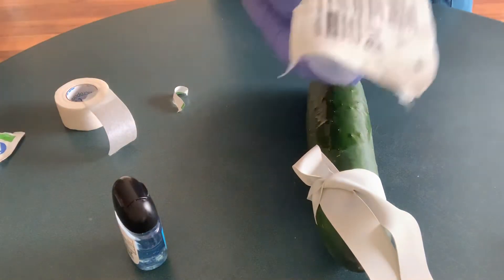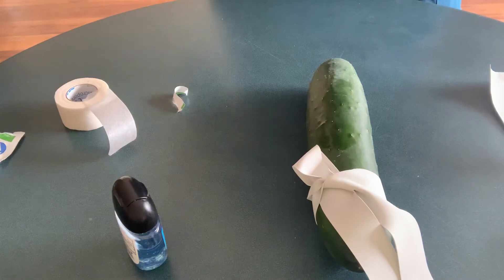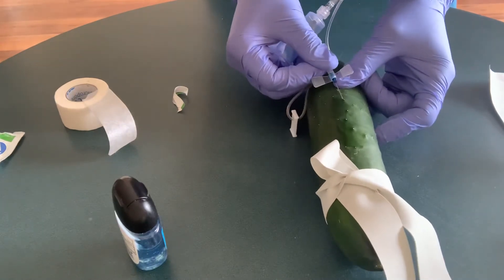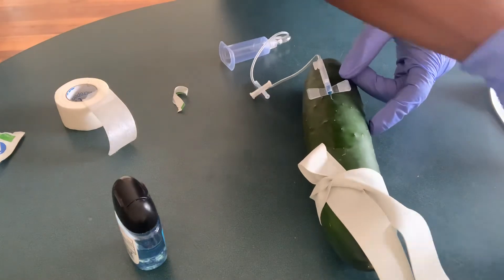I'm going to get my needle and check the expiry date and make sure it's still good. Then I'm going to anchor the vein first, then insert it gently. Start with the red tube.